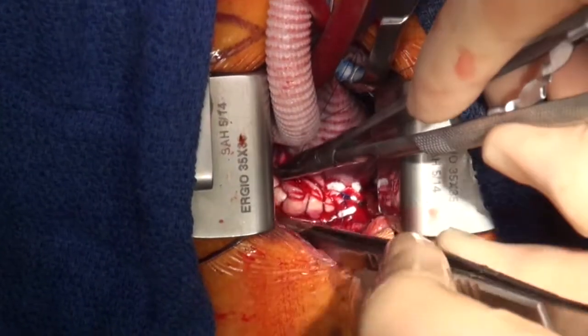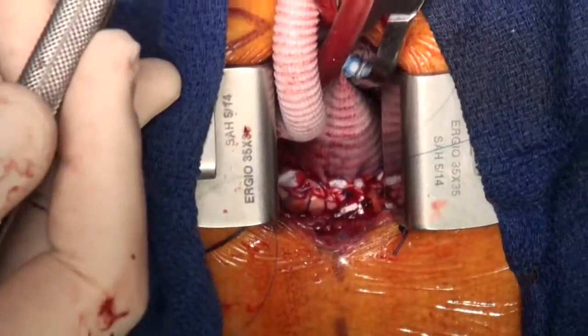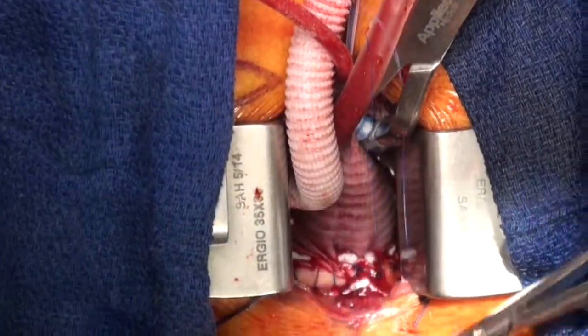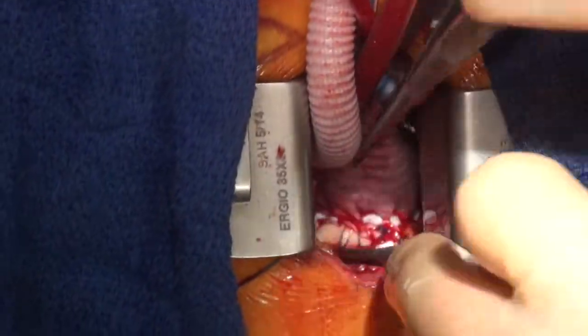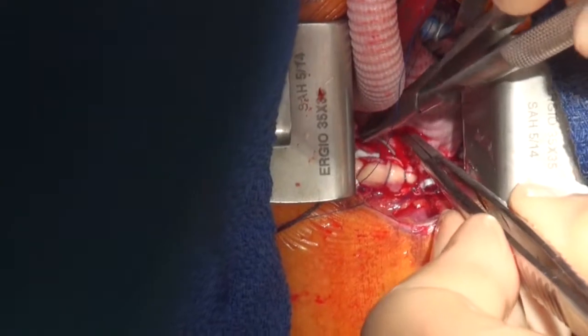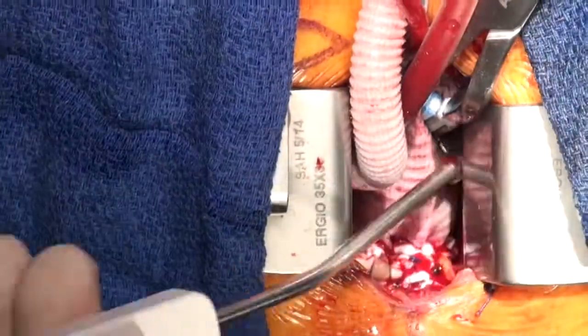It helps to have a good, efficient team and an excellent assistant placing the pledgets. We're very lucky to have Professor Martin Misfield, co-director of the Leipzig Heart Institute, who also performs these operations. He's a visiting professor in Sydney and comes regularly to assist and teach. We're now placing the last horizontal mattress suture — and that's the distal anastomosis performed.